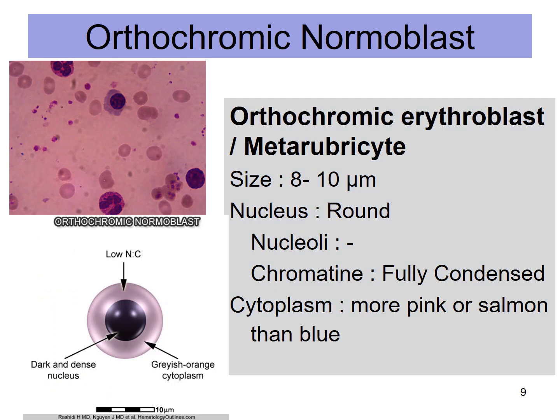The orthochromic normoblast is also called metarubricyte. It is sized around 8 to 10 micrometers with a rounded nucleus. It also has no nucleoli. Its chromatin is even more condensed than the polychromatophilic one. The cytoplasm is pink or salmon rather than blue.